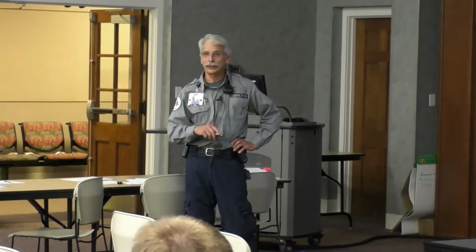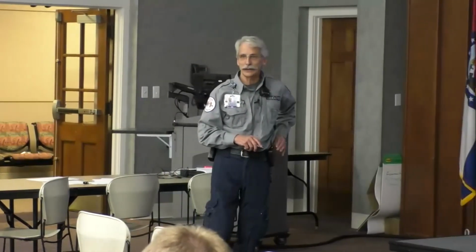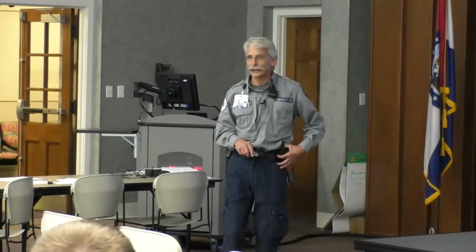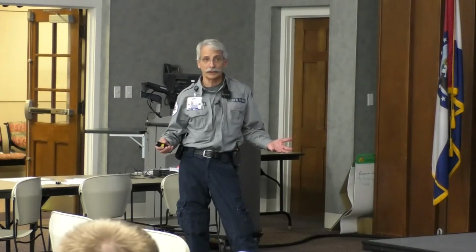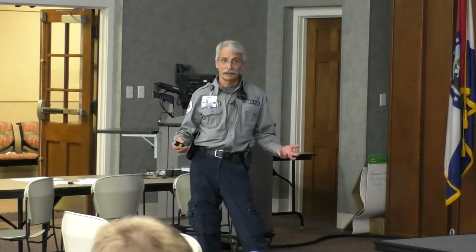So what else should we do to this patient, since we're doing this and we've got 15 minutes to get to the hospital? Now do a right-sided or a 15 lead. Do a 15 lead, yeah. And I don't care if it's just a 13, honestly, but do a 15 lead, all right? Do a 15, because you want to know before you give this patient any nitro, which is part of your protocol, right?